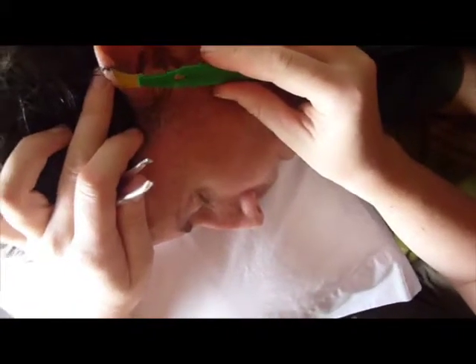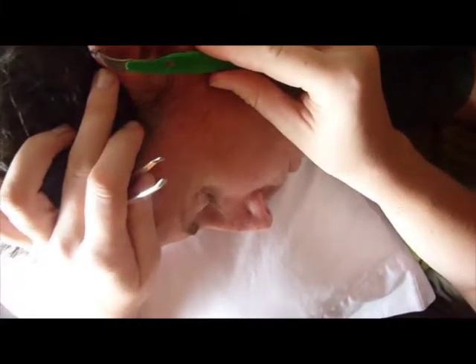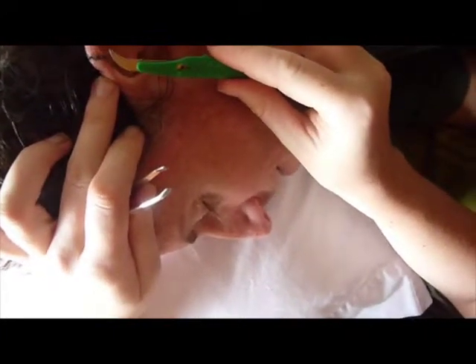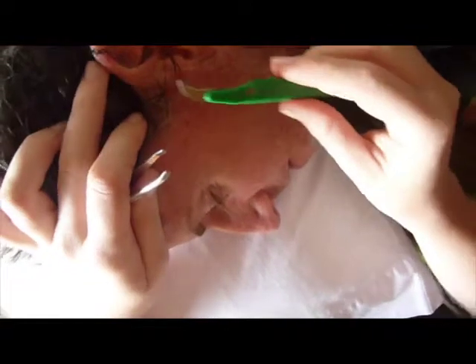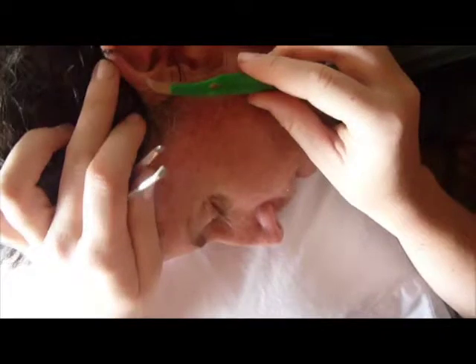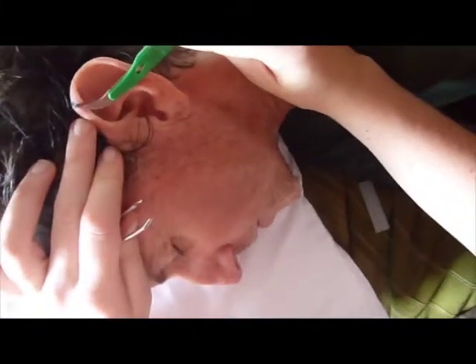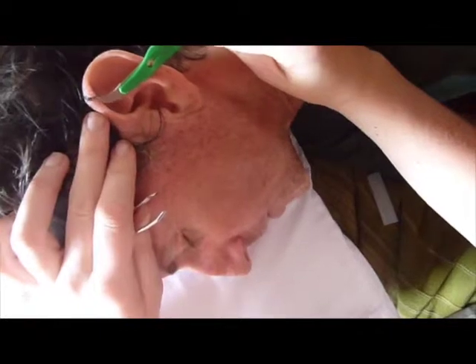So we're filming now. We are in Iquitos, Peru, in the Flying Dog Hostel, and Poodle Schnood is about to remove the stitches which were put in the front of my ear by the doctor the day that we left in the morning. The doctor gave me a scalpel and said, this is your girlfriend to use this scalpel when it comes time to take the stitches out, since we knew that we'd be in the middle of the Amazon jungle — which we are.